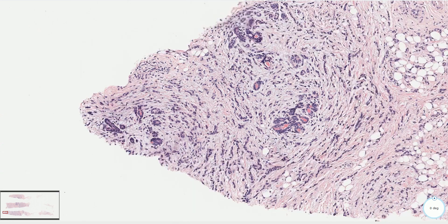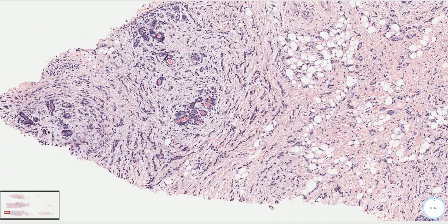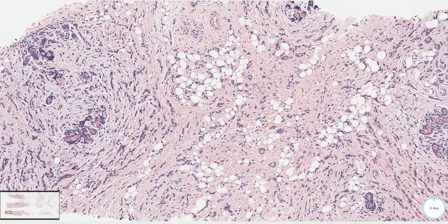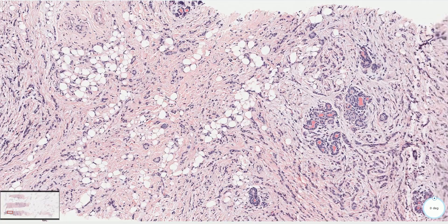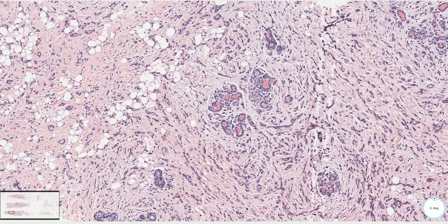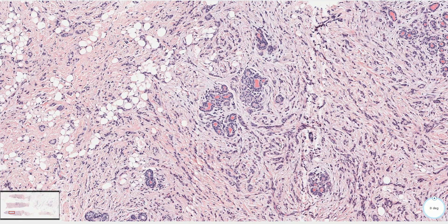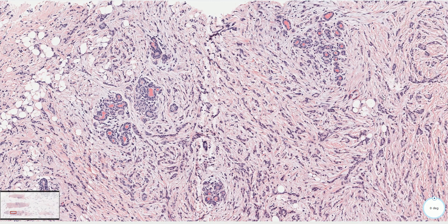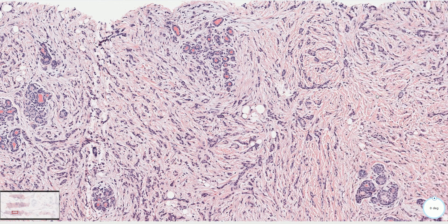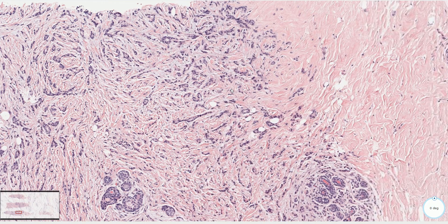It is important to mention that invasive tubulolobular carcinoma is not the same thing as invasive carcinoma with ductal and lobular features, which usually consists of solid nests and strands of tumor cells and well-formed tubules are not commonly seen. Ductal carcinoma in situ is a common component of tubulolobular carcinoma.